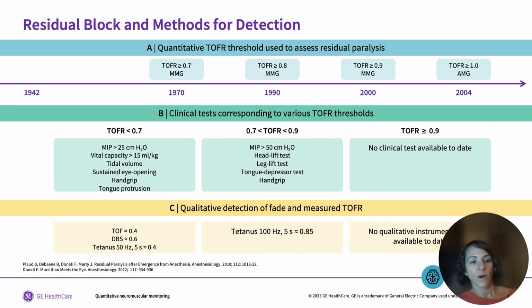So you have that on the one hand, and on the other side you have the clinicians and researchers who are monitoring patients under a neuromuscular block where they're able to quantify gradations of that block, and they directly see the effect of neuromuscular blocking agent on these patients. And so they're looking at this like, well, you can't see these things in an anesthetized patient, so how do you know when the patient is fully recovered? And so there was a drive to try to show that none of these clinical tests were really reliable. And we did just that.